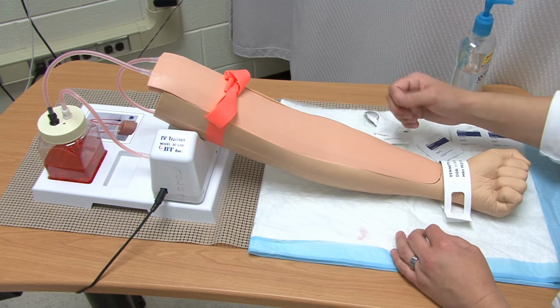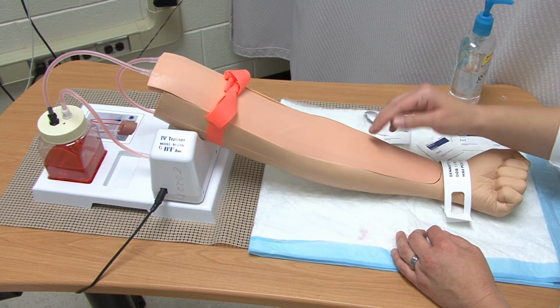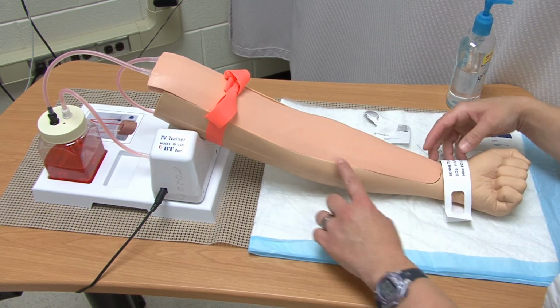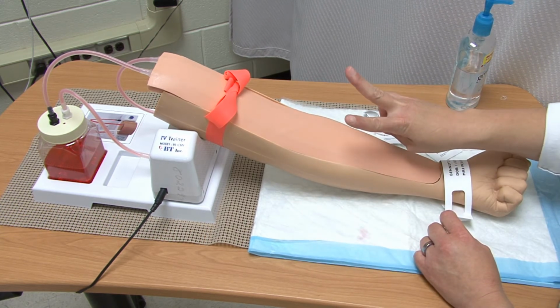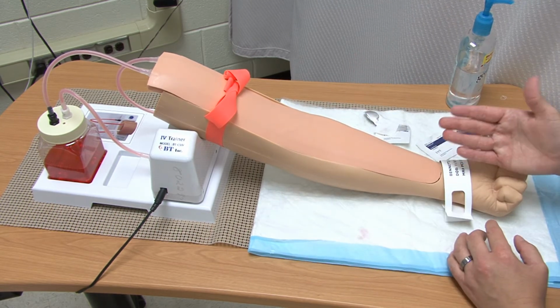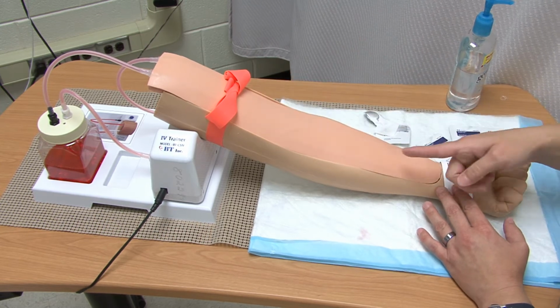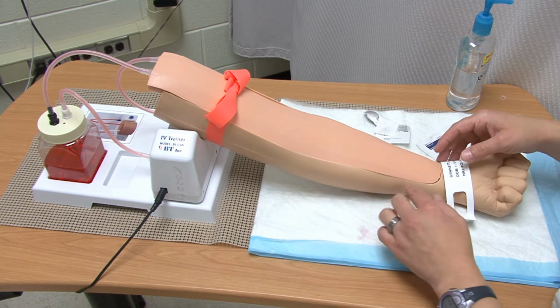As I'm looking through here, I want to make sure that I've got a vein that's large enough to accommodate the gauge of the needle, which is the diameter, and also the length of the needle. If you look through here, these are pretty straight. You want to stay away from any bifurcations in the vein. If it does bifurcate, you'd want to go above it. And remember, when you start it, it always goes toward the heart, okay? So when you insert, the catheter is going toward the heart and the upper part of the arm.